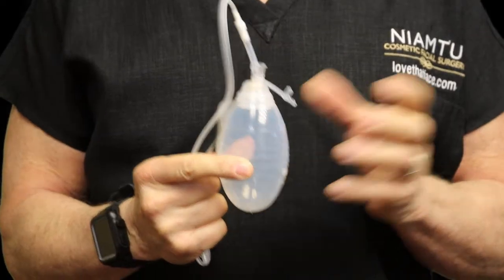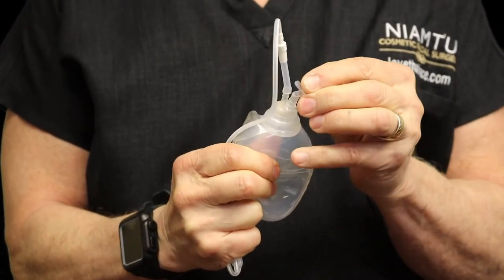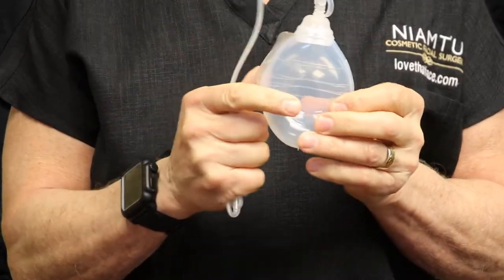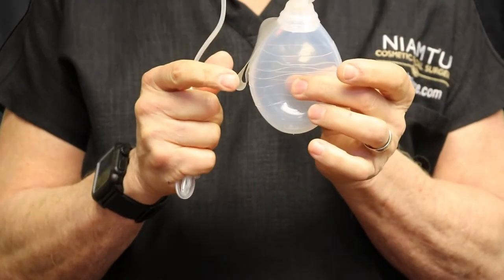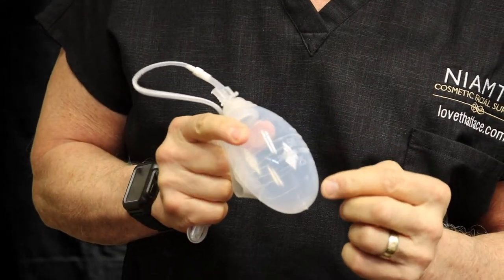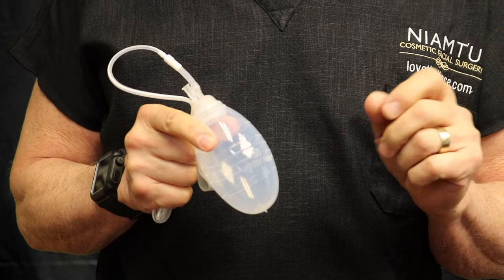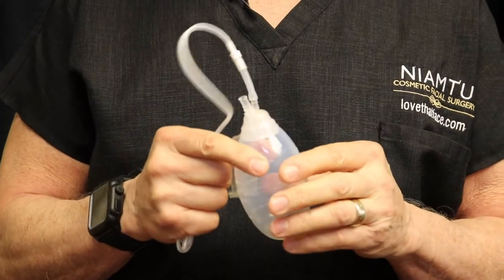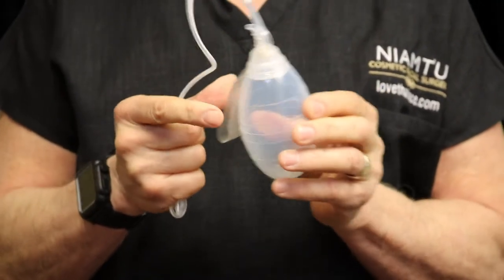The way this drain works: you squeeze the little bulb, there's a little tab, and you seal that port. When you release it, that creates a light suction or vacuum, which suctions the blood and blood products up through the drain and collects them inside the bulb. When you open it up, you can see markings in milliliters — 25, 50, 75, 100. The average patient probably has somewhere between 50 and 75 ml on the first day of surgery, with a decreasing amount after that.